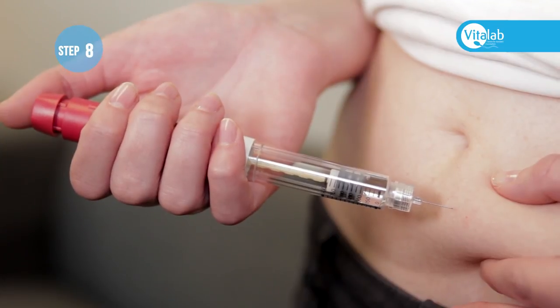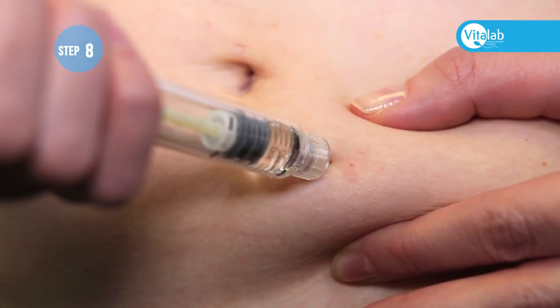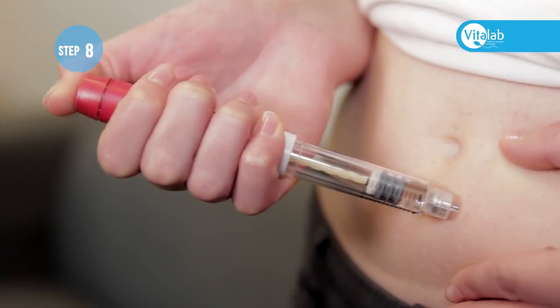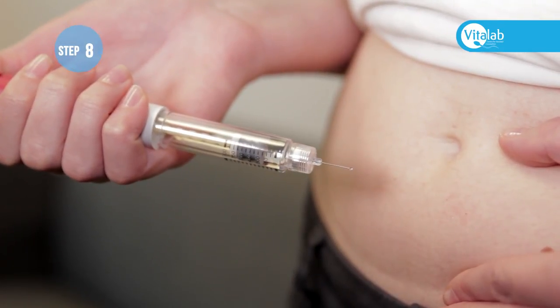Inject the medication. When the needle is in the abdomen, press the back of the pen to inject the medication. Count to five, making sure that the full dose has been injected. The red part that has been turned must go all the way back in.